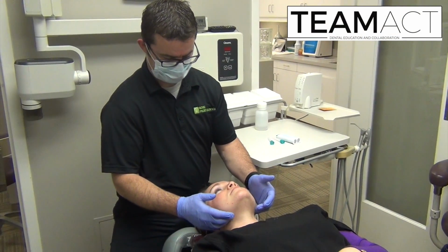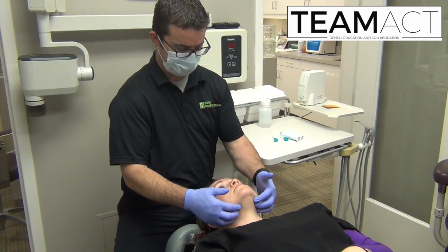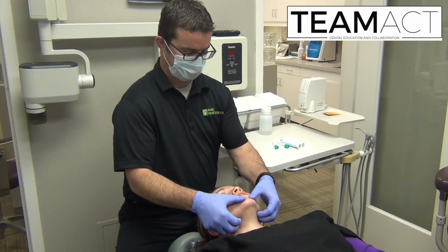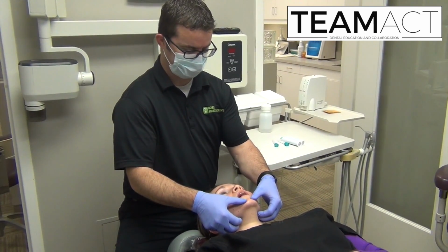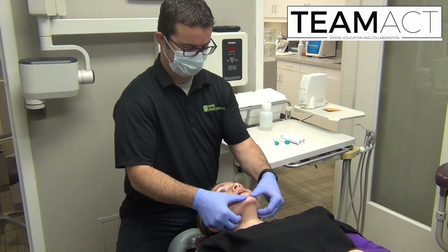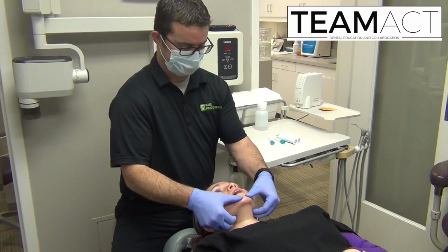As you can see, I'm going to lightly rest my fingers along the inferior border of the mandible, posteriorly supporting the angle of the mandible. My thumbs will lightly rest on the anterior portion of her chin. I'll have her open and instruct her to relax while I place light downward pressure on her chin and light upward pressure supporting her inferior border of the mandible.